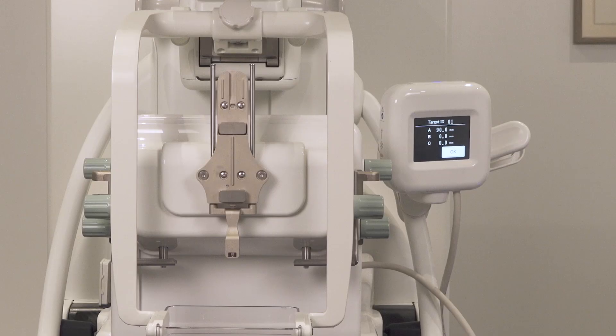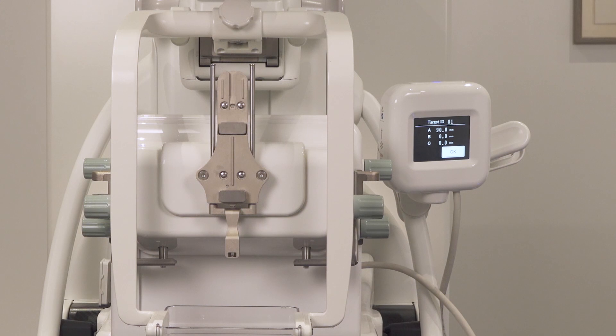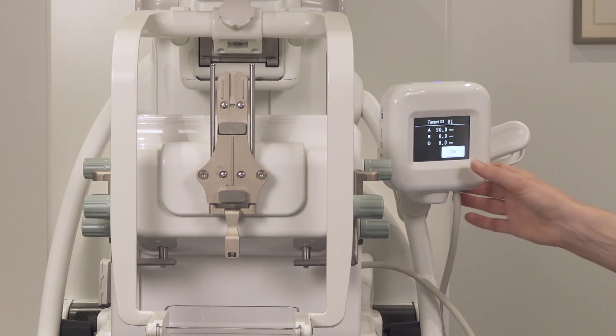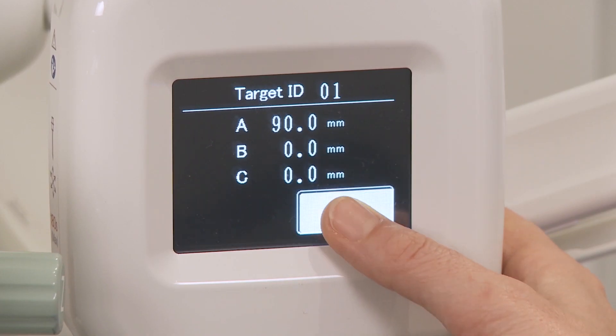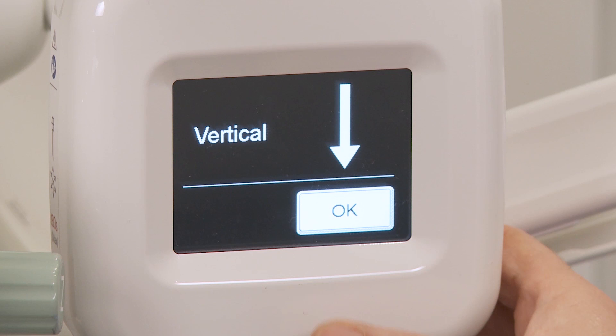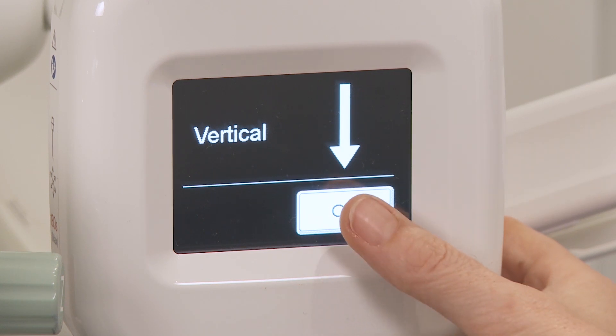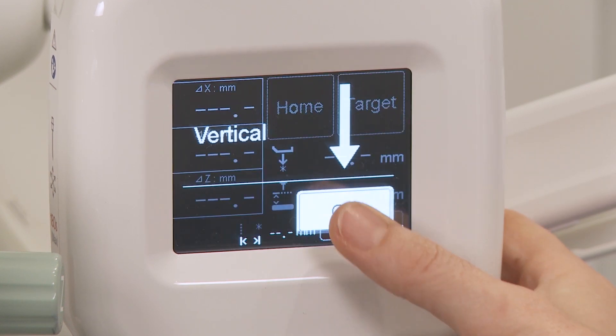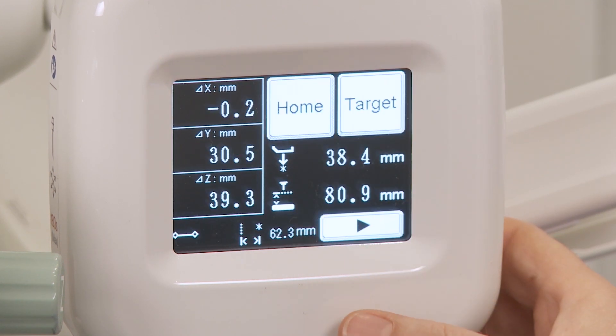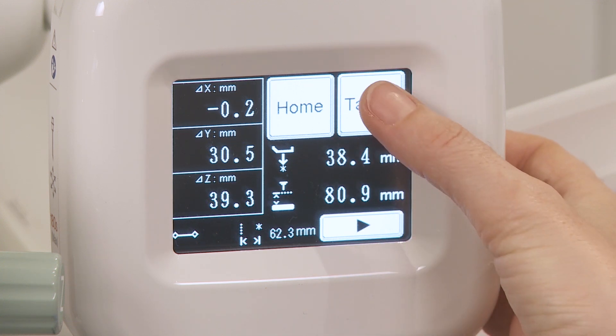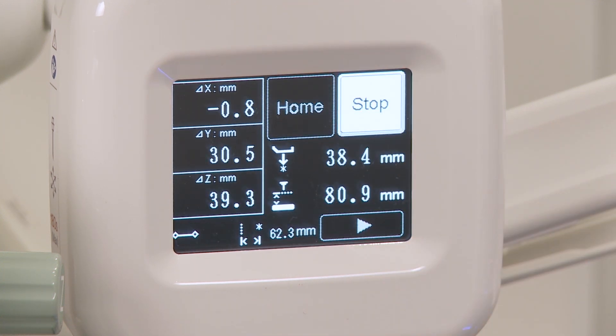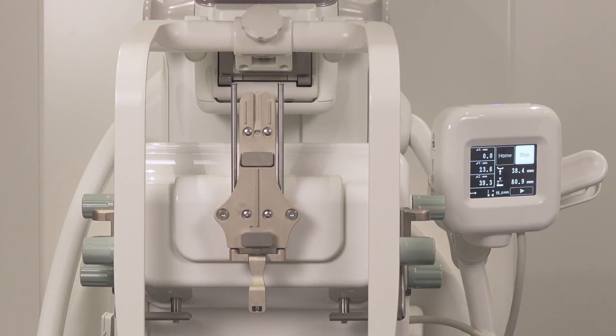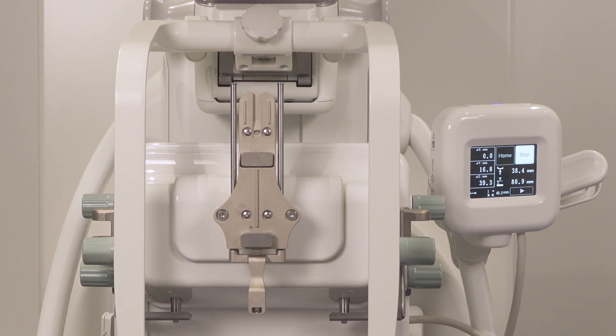The operation panel shows the target ID and calibration needle length. Press OK to confirm. Press OK to confirm vertical approach. The target information is displayed. Press the target button to drive the needle holder to the selected target coordinates.